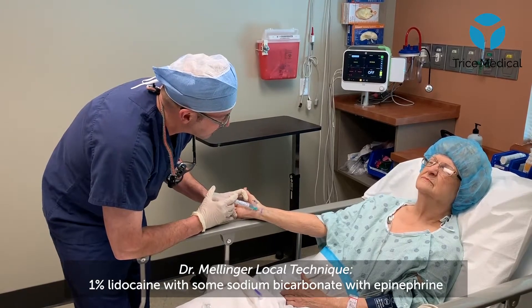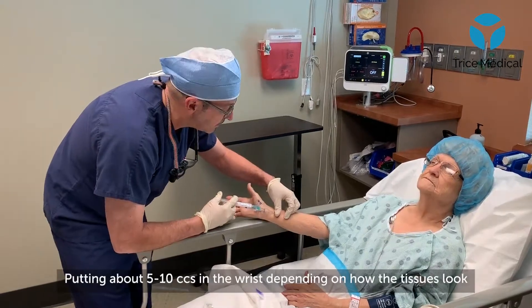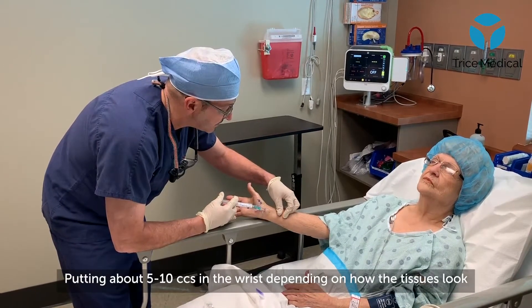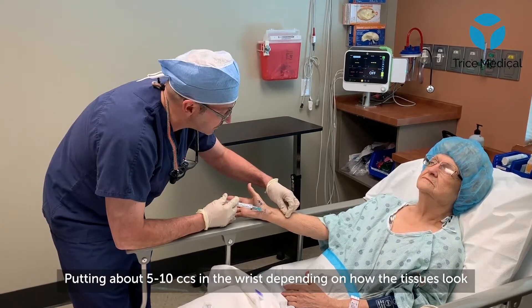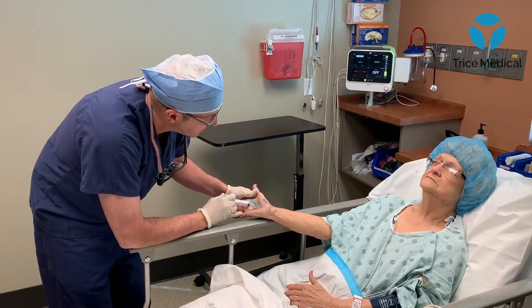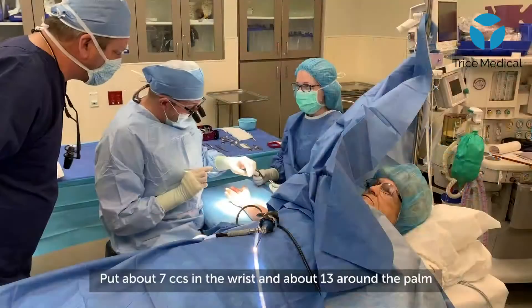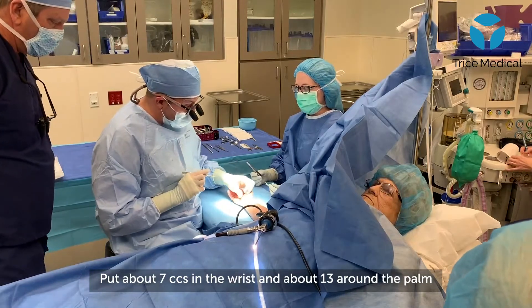3, 2, 1, prick. So sorry. About 5 to 10 cc's right in here depending on how the tissues look — I put 7 in there. Then another injection: 3, 2, 1, prick. So in total I did about 7 cc's here and about 13 around the palm.